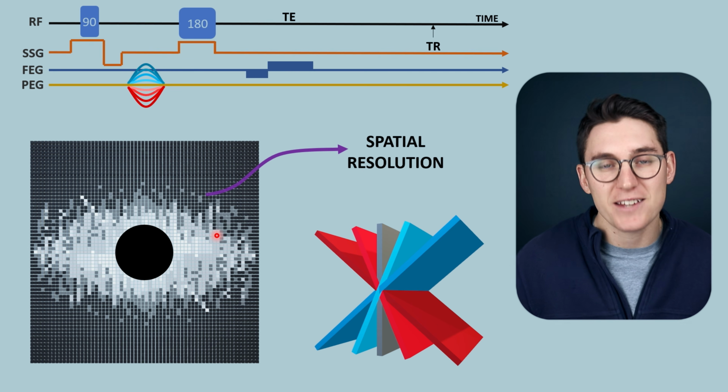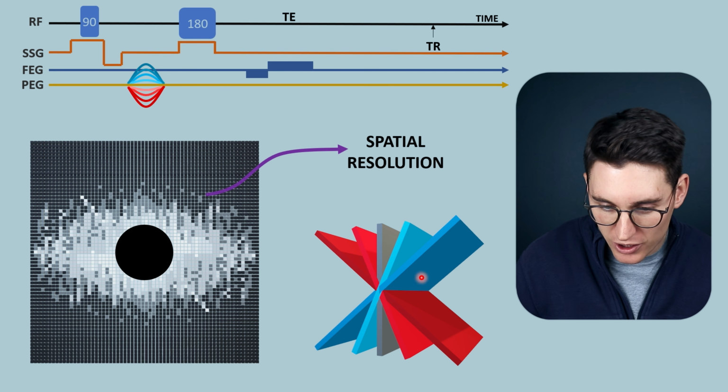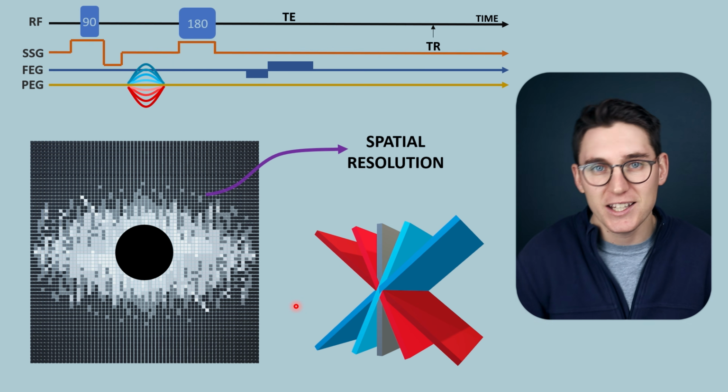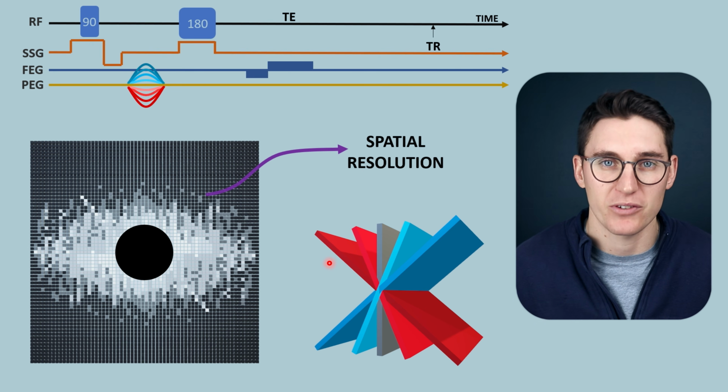Now, we can represent the rate of change by a waveform. And the stronger the phase encoding gradient, the faster that rate of change of dephasing as we head up our y-axis. The more frequency that rate of change has as we head out into the peripheries.